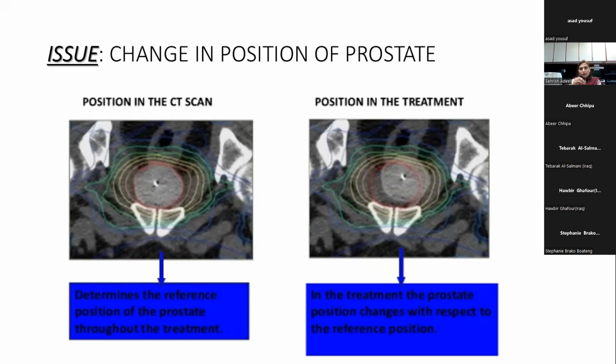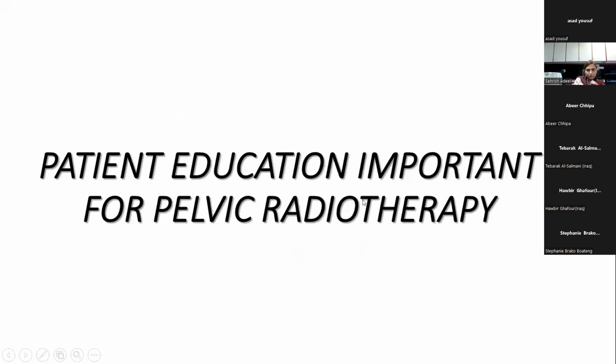Okay. So this happens in prostate cancer patients, that because of the organ motion during the treatment, the prostate itself may miss from the target, it may miss from the treatment. So I think in our 2 years of learning from IGRT, especially from the cone beam CT scan, it's very pertinent to discuss the importance of pelvic radiotherapy.